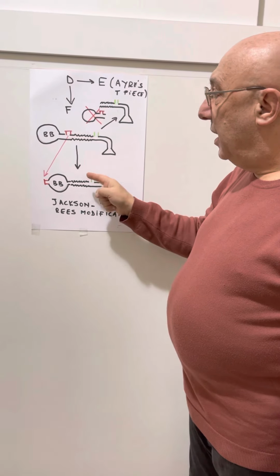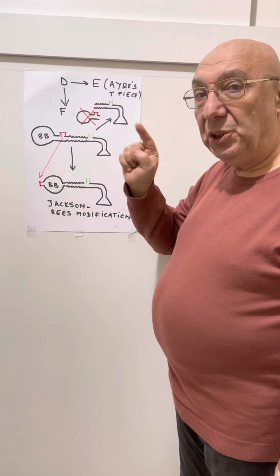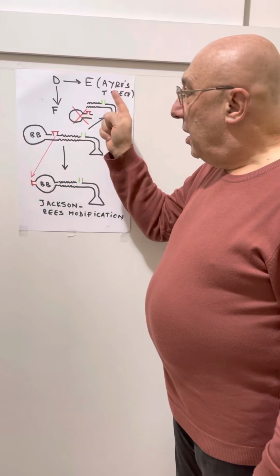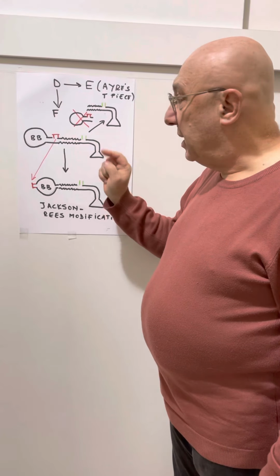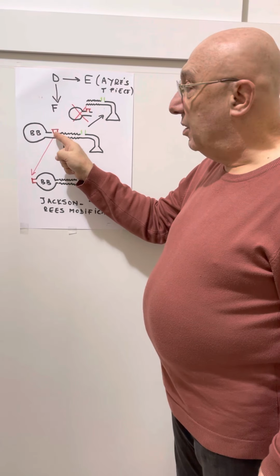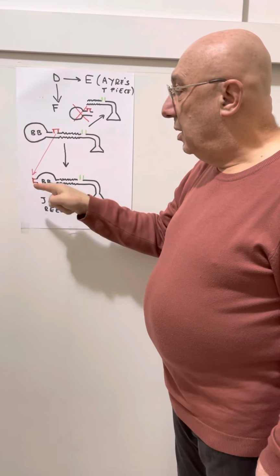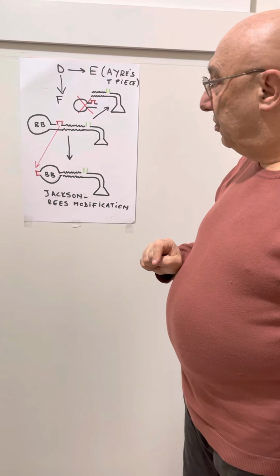And going back, there is another jump. You remember the fresh gas inlet made only one jump from A to B, but then the fresh gas inlet stayed only in one place next to the mask. Here, this is the last jump that the pop-off valve is doing from before the balloon to the next balloon. This is a Jackson-Rees modification.